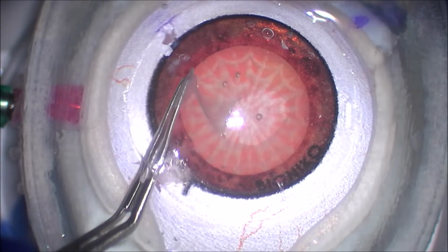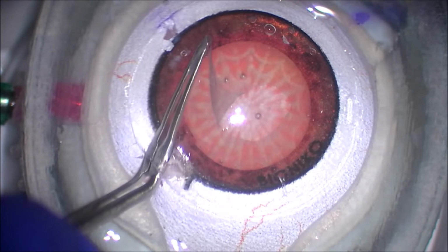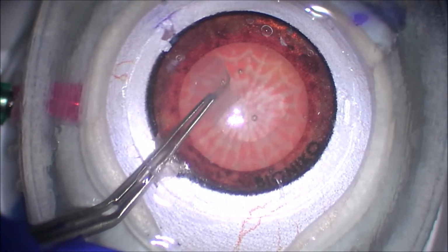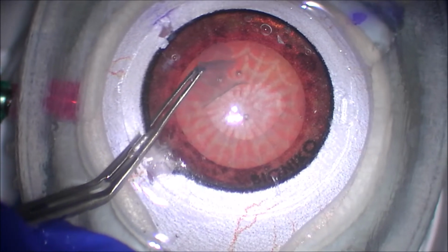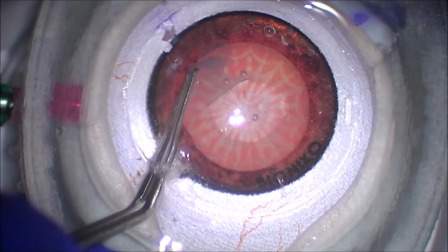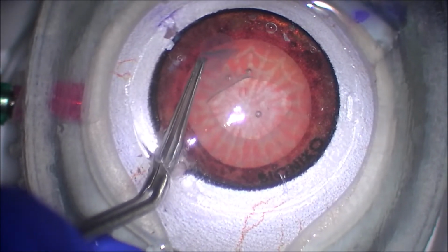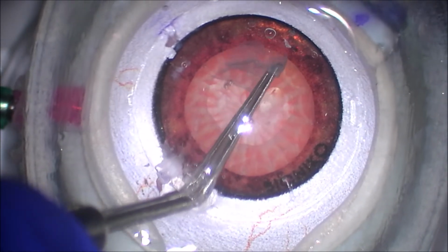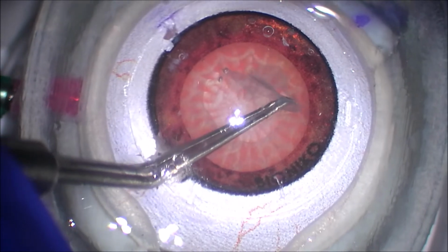She was able to turn that corner real nicely, grasping the flap again before it could fall back down. And you can see she's going around the best she can. And again, she's redirecting the forces, which is a really great maneuver right there. And pulling again away as she is here. So again, I think she did a really, really good job.